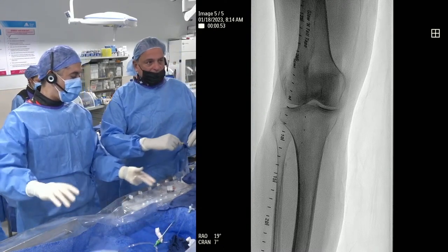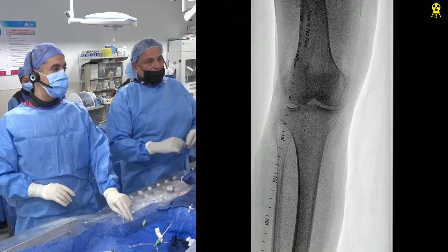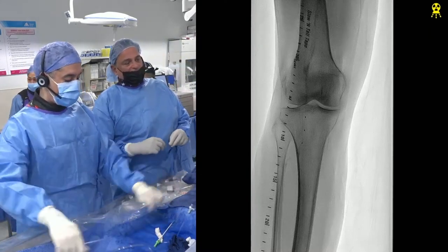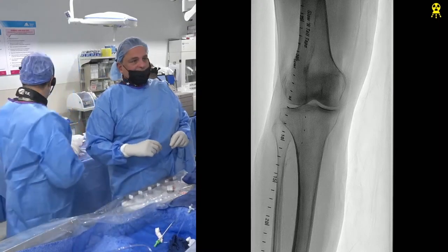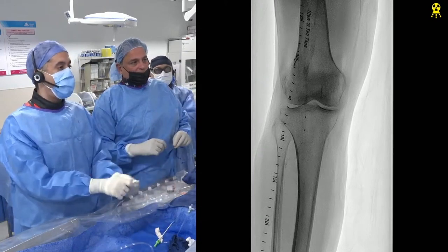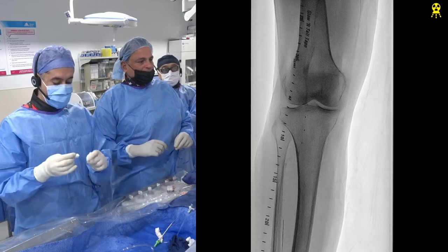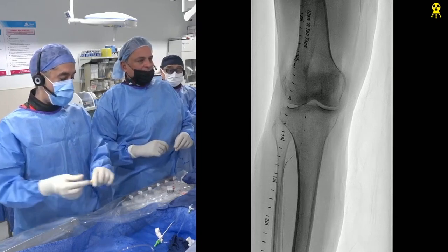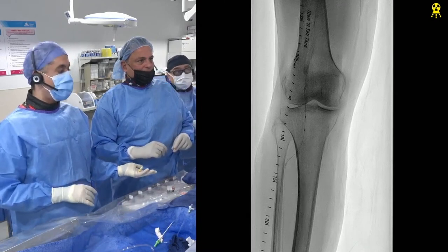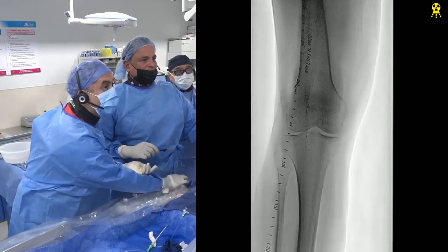The other thing also, Raman, I think these are great points, and that's why we chose this case. The other point is, you could say, well, I'm going to fix the subclavian and come down through the arm. But then you're talking about, she's not a very tall lady, but you're probably talking about suboptimal peripheral equipment for this kind of case, right? I know the radial sheaths are there, and you can technically reach. But the issue is how that's going to work for you to be able to get all the way down and do your thing. Advance that a little bit, right?